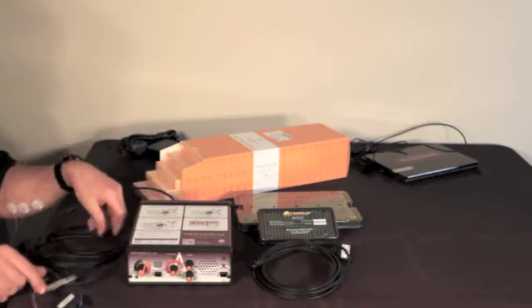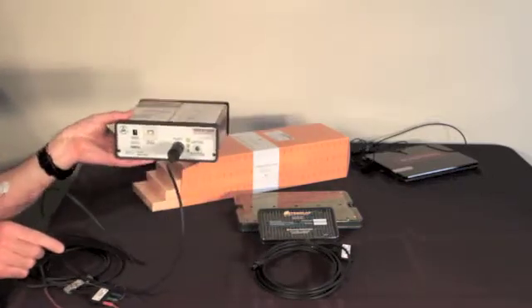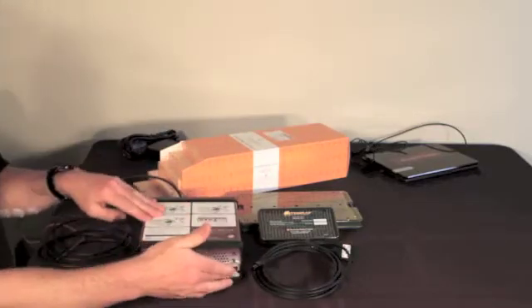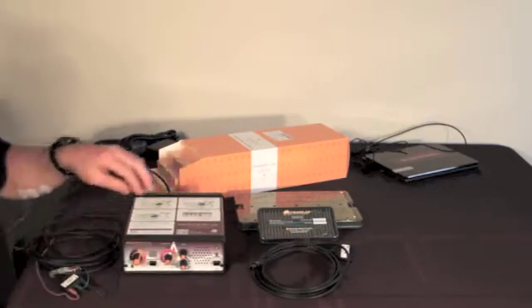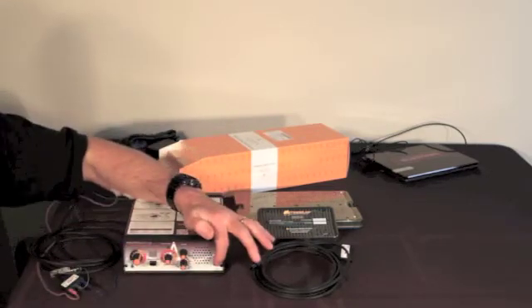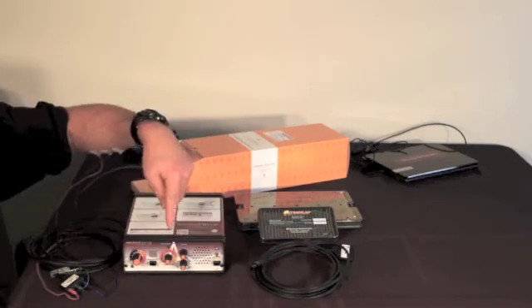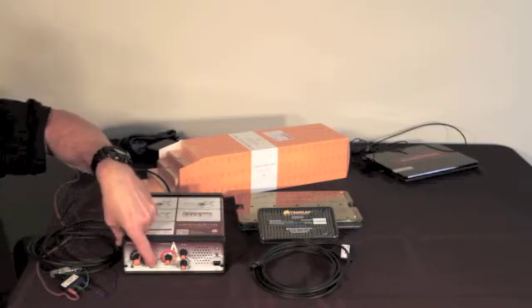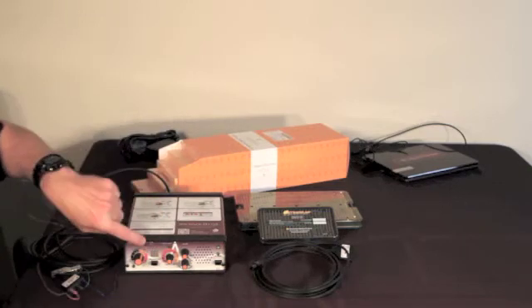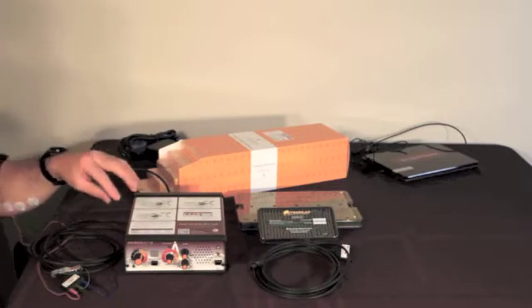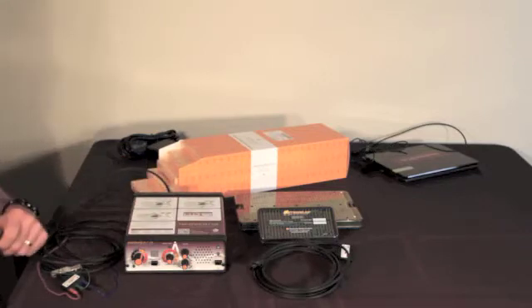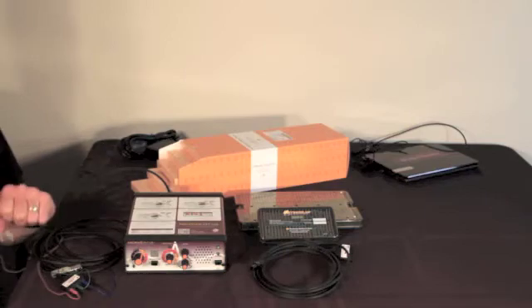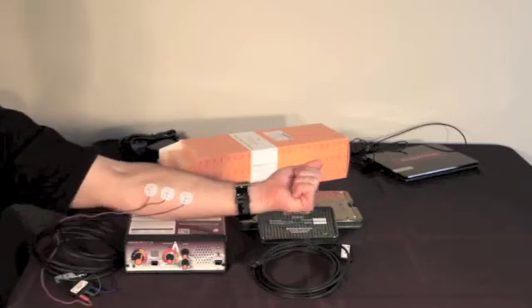At this point make sure this EMG cable is connected to the back of the Nirvana machine at the port labeled EMG and turn the machine on. At this point the sterile field hasn't really been set up around the patient, so you're able to test this connection and if necessary go back and reapply electrodes. Once I've turned on the machine and I have my signal amplification at 100%, I hold this test button for at least 6 seconds. And then I watch when I release the 3 readings that appear. In this case I had 10, 16 and 7.8. Referencing my Nirvana impedance guidelines on the top of the box, I can see that I needed to make sure all 3 of those numbers were under 20. Confirming that that's the case, I now know I've got good connection to the patient.